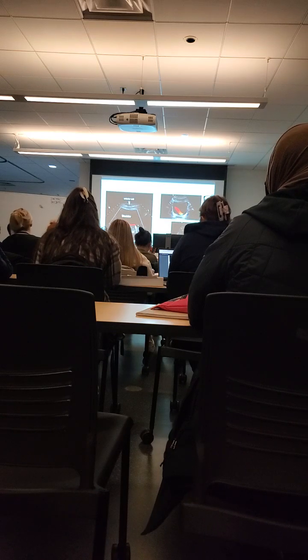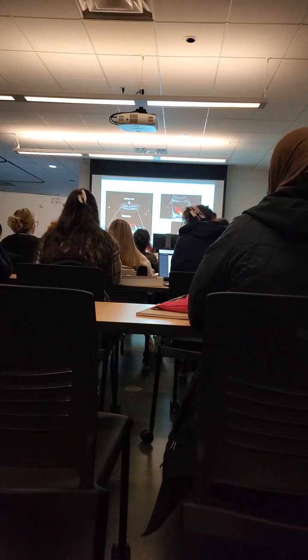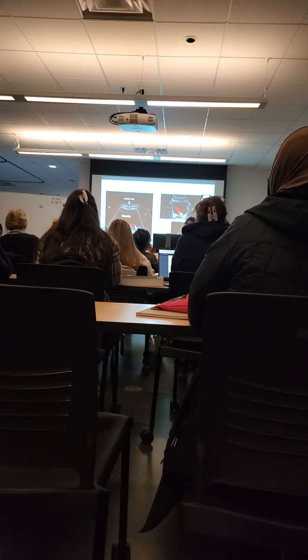Now, if we know they're coming out in the posterior aspect, where should our probe be if we're in transverse? Should we be superior, mid, or inferior? Inferior, because that's the most posterior aspect, right? So you're going to shoot down like this, and you're going to look for the trigone. There's going to be a little lump like this, and that's how you're going to get it.